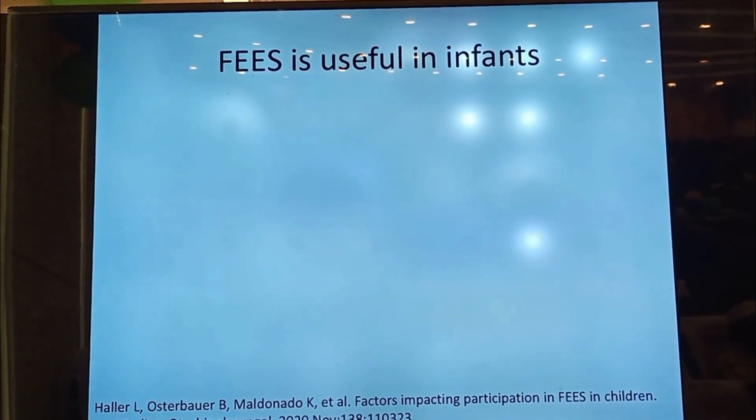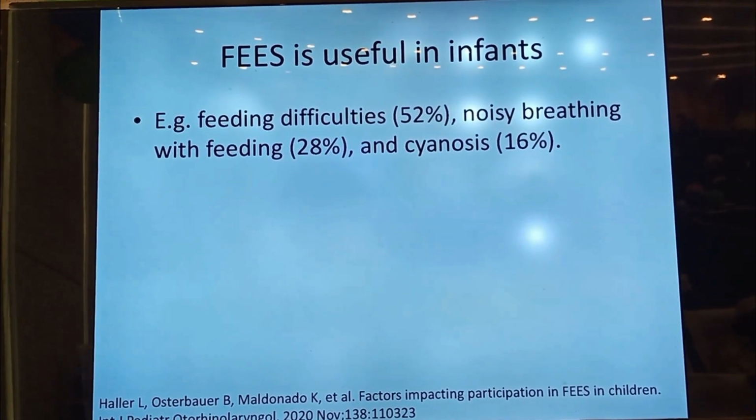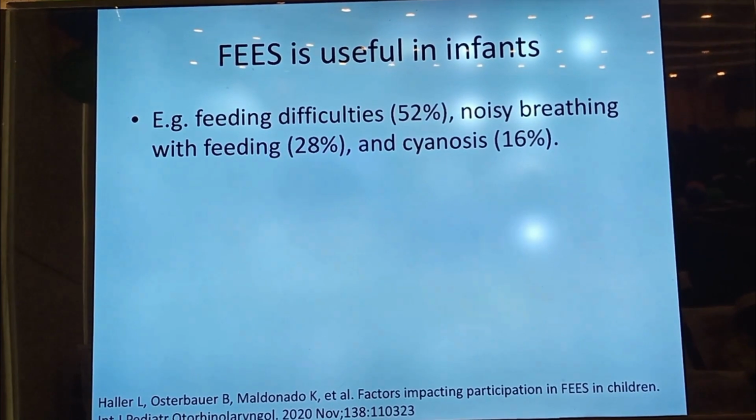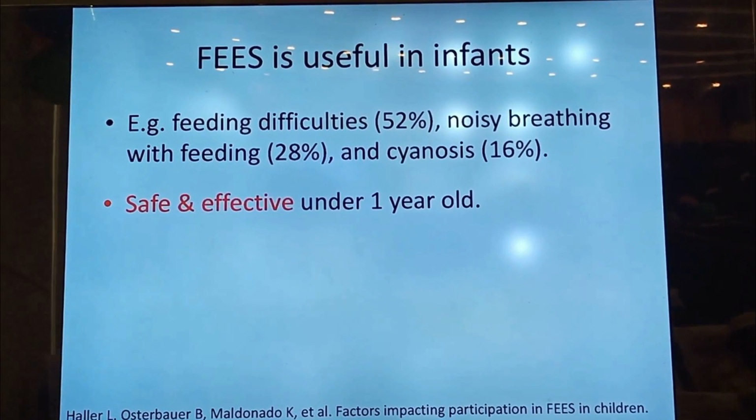FEES can also be performed in young children and infants. For example, if they have feeding difficulty, noisy breathing with feeding, cyanosis with feeding. It has been used safely and effectively in children under 1 year of age.